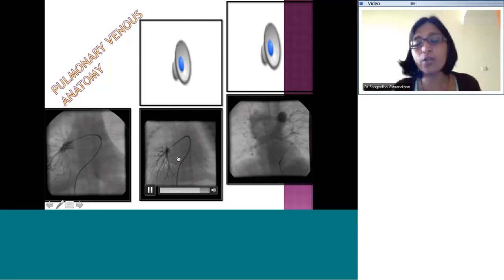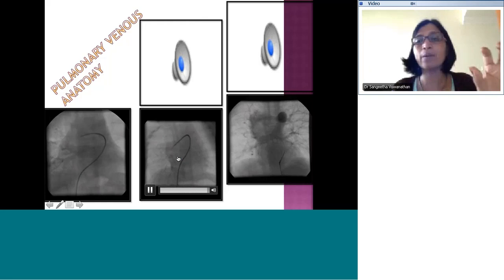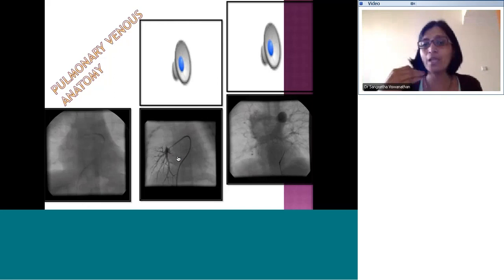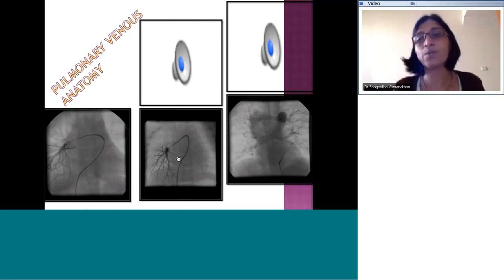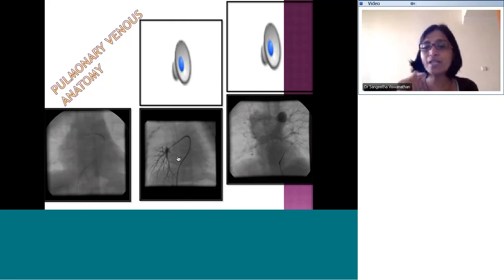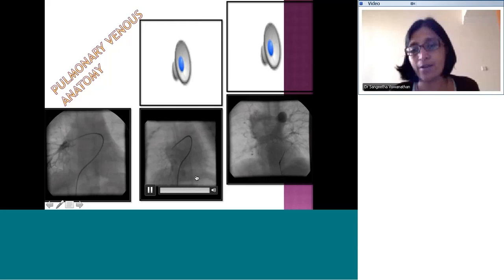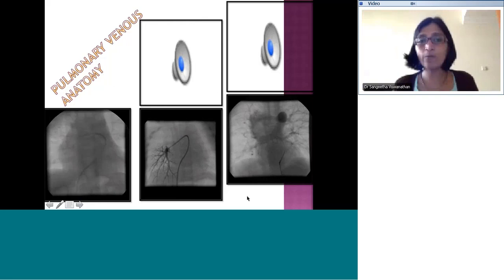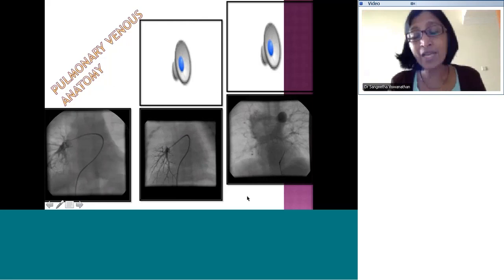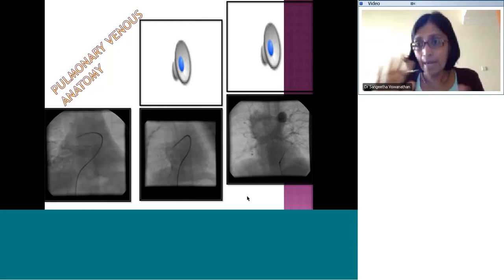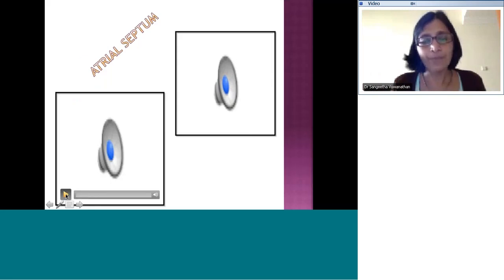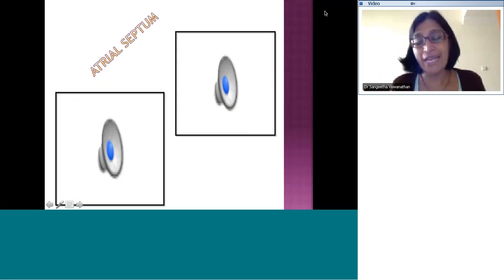If you want to selectively look at the pulmonary venous drainage of a particular segment, engage the specific branch of the pulmonary artery and inject selectively. Sometimes you can use a balloon-tip technique to get a better angiogram. When doing pulmonary vein intervention, the LAO view can sometimes be useful.